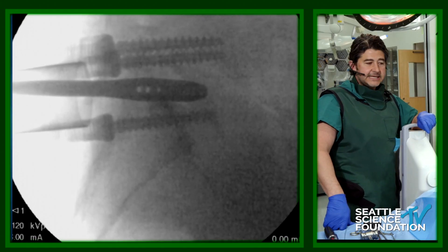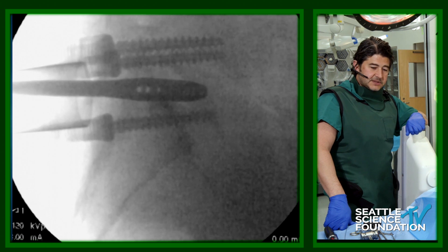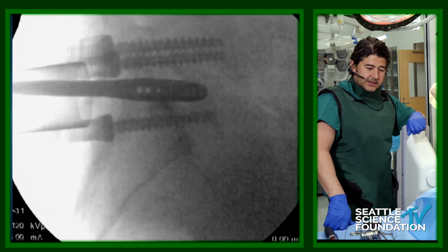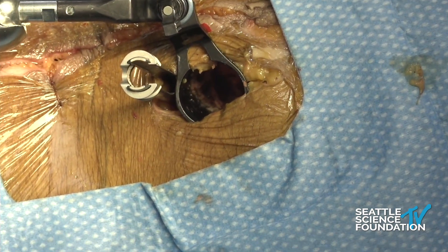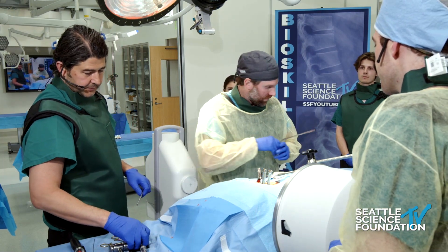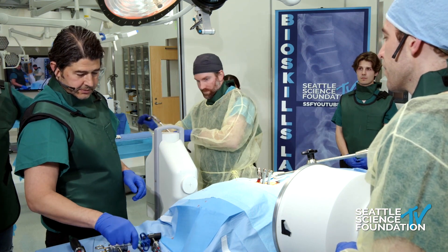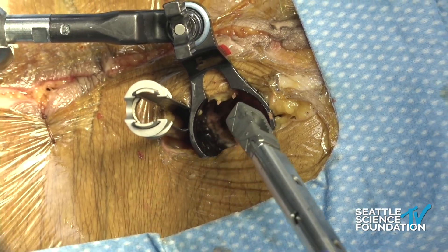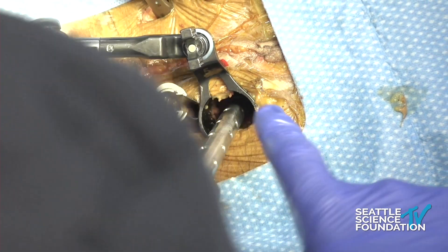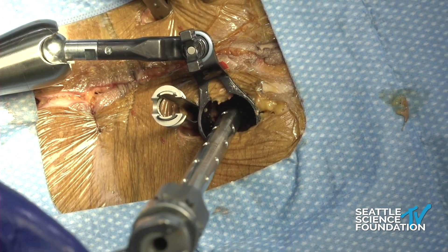Do you find this technique easier or better? Honestly, it depends. If it's a grade one slip, you can keep going. If it's a grade two or grade three slip, those are more difficult because it's collapsed. The more collapsed they are, I'll tend to do the interbody first. What do you normally do? I normally put the interbody first, because the screws sometimes can get in the way. So it's just personal preference. I put a cage to one side and put screws on the contralateral and ipsilateral side too. I use the same incision I put for the interbody to place the percutaneous screws.